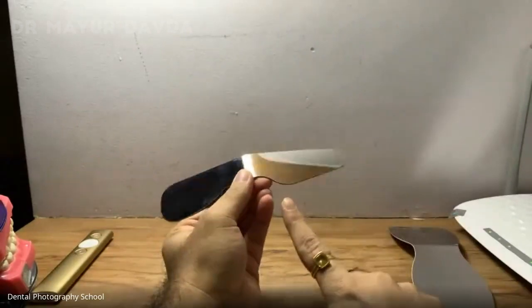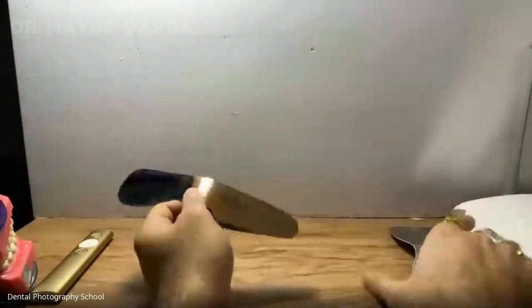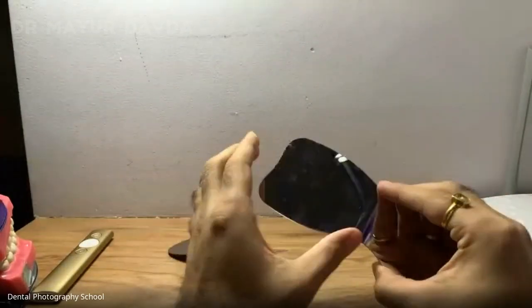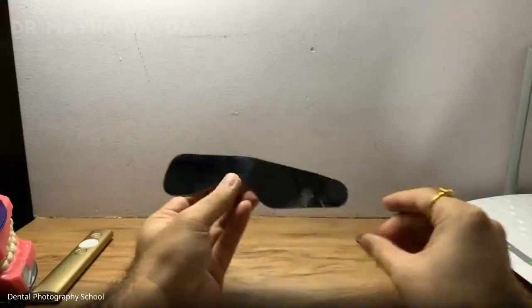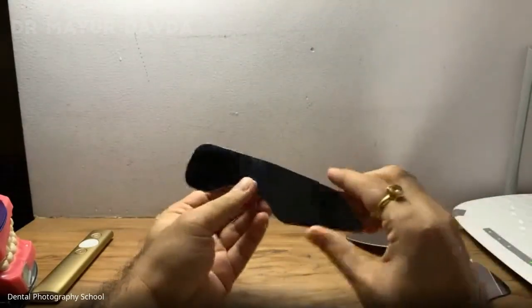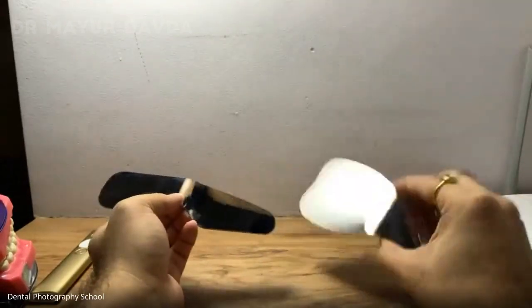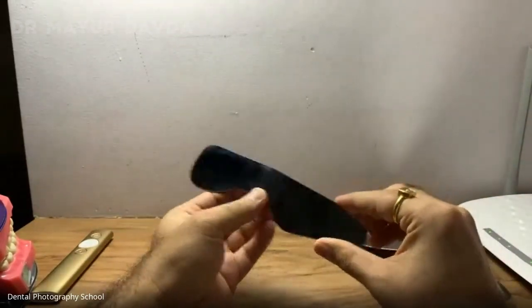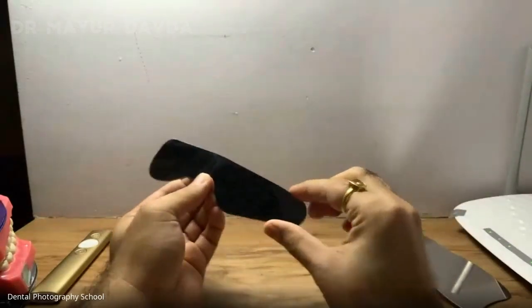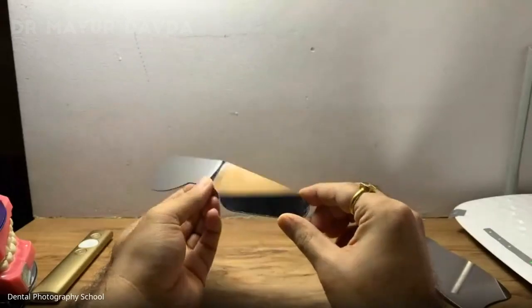We always use the convex side of the mirror. But if you are doing quadrant dentistry, this is the mirror for you. In case this gets scratched, maybe you can use this one, but only put a part of it. Don't try to put the full thing inside the child's mouth. So this is one tip that most of you can take home: try to use smaller accessories for pediatric patients and not big ones. This is for recording quadrants. You can record the 5th, 6th, 7th, or 8th quadrant with this.